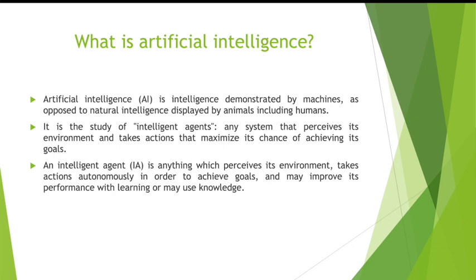The cost function goes higher, and the algorithm is programmed to keep the cost function to a minimum. So if it makes a mistake, the mistake is fed back to the software, and the software modifies itself. Now, what does it do? You don't know what it does because you have not specifically programmed it to do something. You have only programmed it to learn intelligently by itself about what to do.